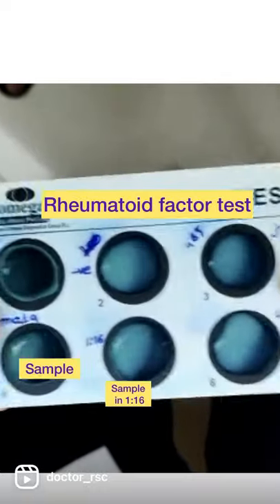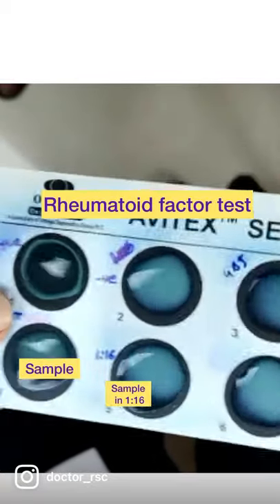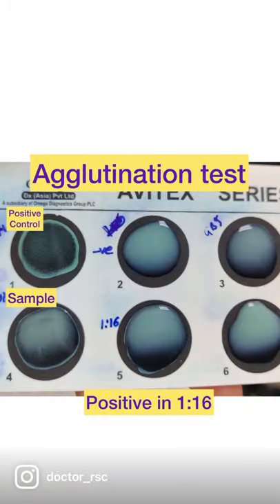The sample is put in dilutions of 1:16, 1:32, and 1:64. We keep moving in such fashion, and then we see agglutination which is positive at 1:16. This means the sample is positive for RF factor.